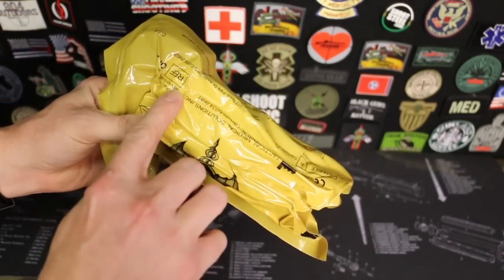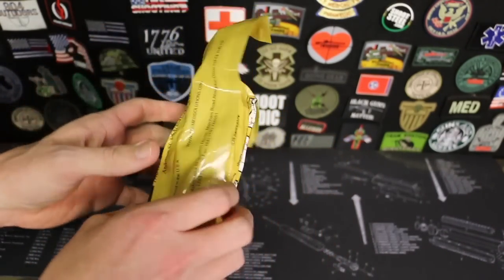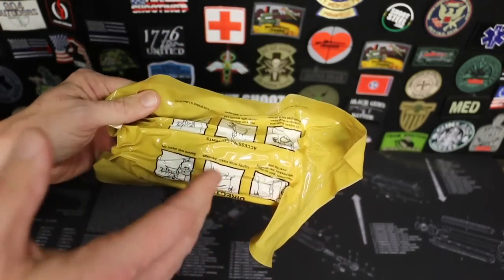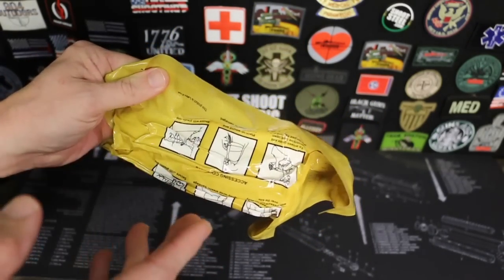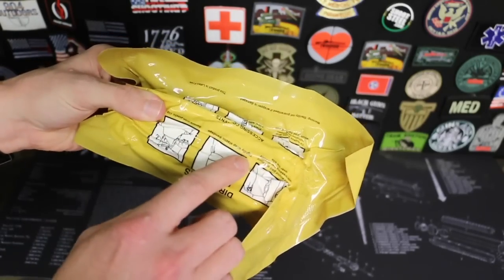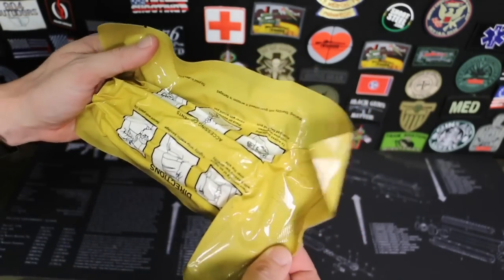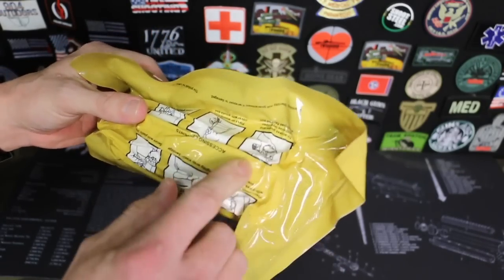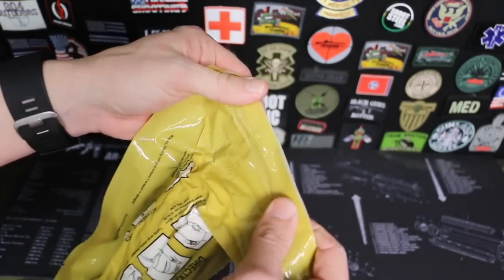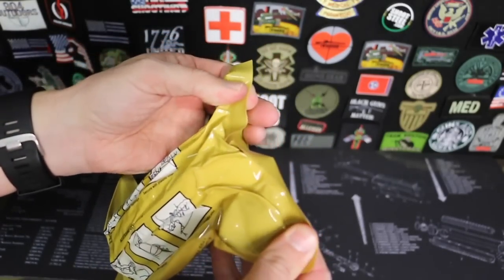We'll take a quick look at the overall packaging. This is the 6-inch version. They make a 4-inch version and also a flat version as well, depending on your application and what you have room for in your kit. It has directions on it, so if you want to hand this off to someone who's not familiar with how to use it, or if you have a brain fart in the middle of using it, the directions are right there. We have pull tabs on the center and also pull tabs on the end.